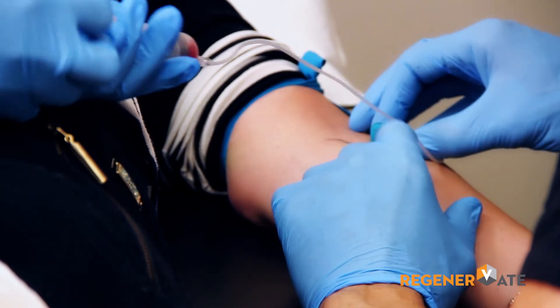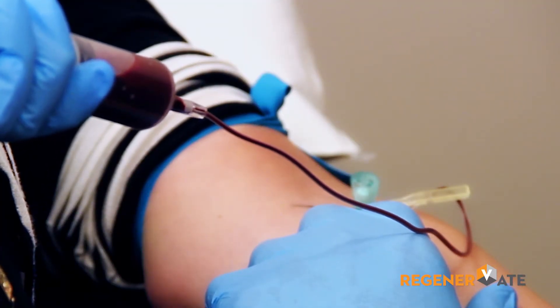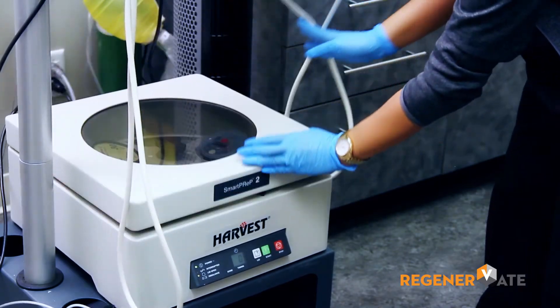Our PRP injections start with drawing a patient's blood. The amount drawn depends on the system used, but once the blood is drawn, it's placed in a centrifuge and spun down.